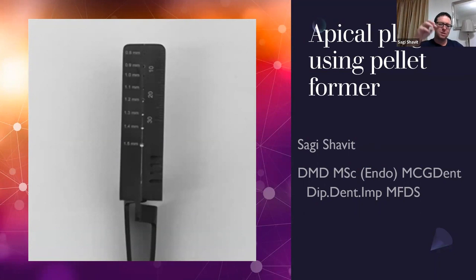Plus the new MAP system, with the Nitinol tube that goes back into shape, and the pluggers inside the plastic ones, were kind of single use, so it all becomes very expensive. In straight canals it was fine, but for apical surgery, when you needed to put curves on it, they brought in the more flexible ones. But they're very technique sensitive to use.